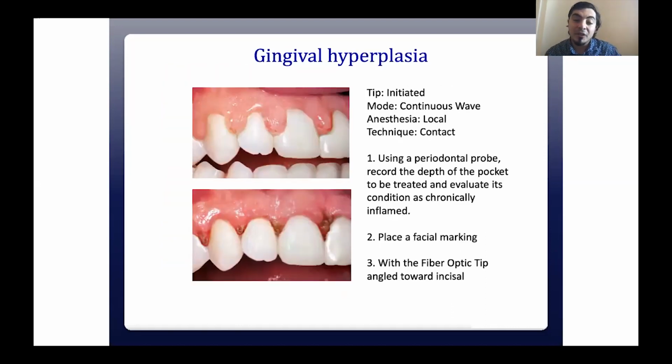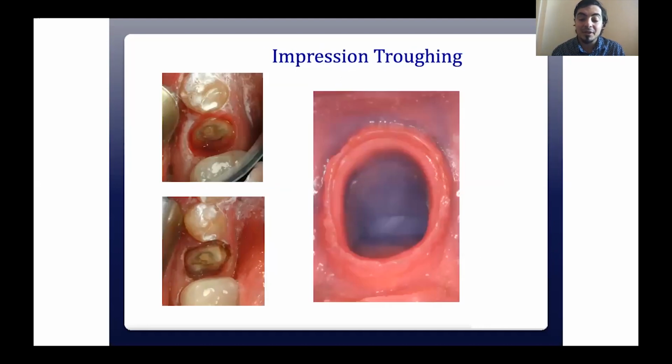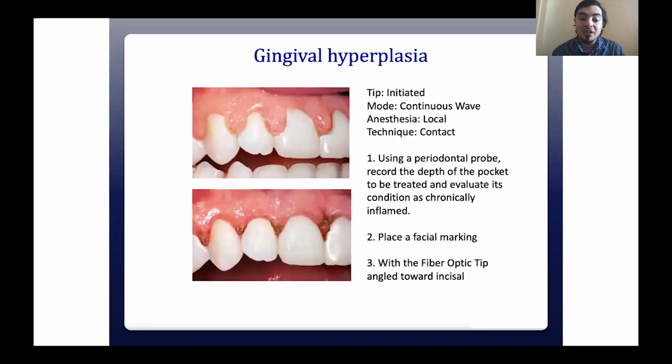Very similar with gingival hyperplasia. So another classic case. This is a drug-induced one, so obviously there is more to this case than just reducing the bulk. But we can use the laser to reduce the bulk, and once it's healed a couple of weeks later, it should settle very, very nicely and reduce back down to normal levels.